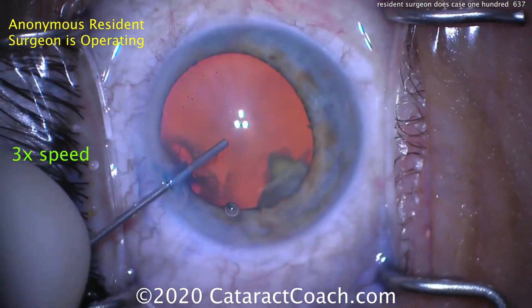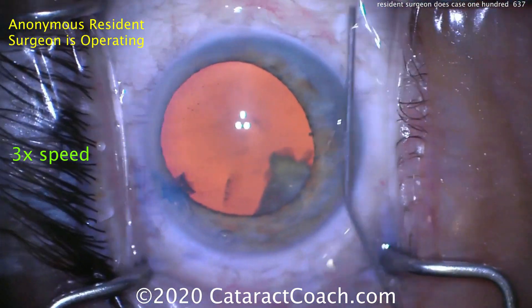Now we sped the video up to three times normal speed. That's a good fill of viscoelastic.